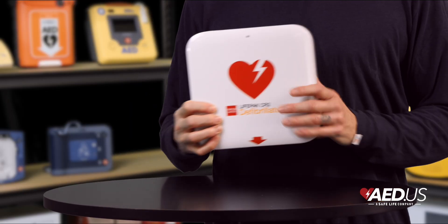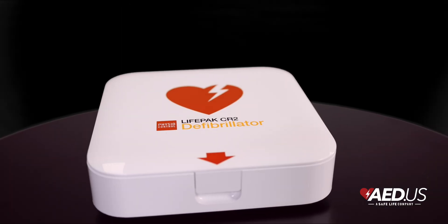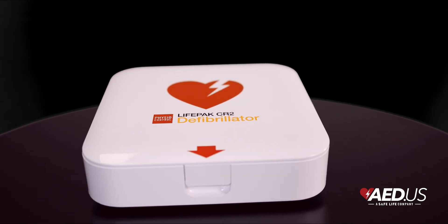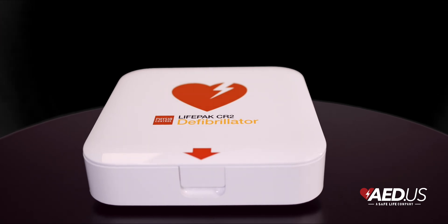Built tough, the CR2 features an IP55 rating for dust and water resistance, making it dependable in both indoor and outdoor settings. And with a four-year lifespan for both the battery and electrode pads, maintenance is minimal so you can focus on readiness without consistent upkeep.